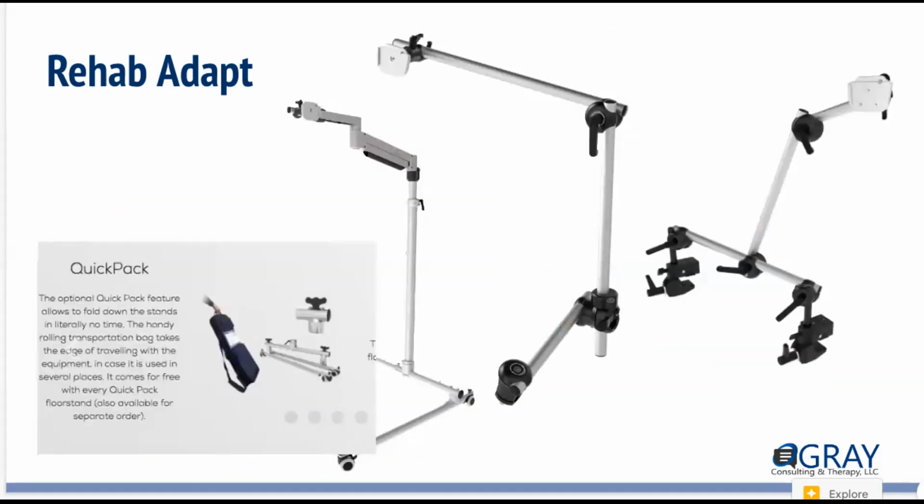They have some nice options. This is the Vero for that rolling mount. Again, gets around chairs nicely. Can go under a bed, does tend to not work quite as well in small areas. And then we have this double table clamp option, which can work really nicely in a variety of places. I've done it on a bike, in between two seats in a van, so that the client would be able to use their device while traveling in the van.